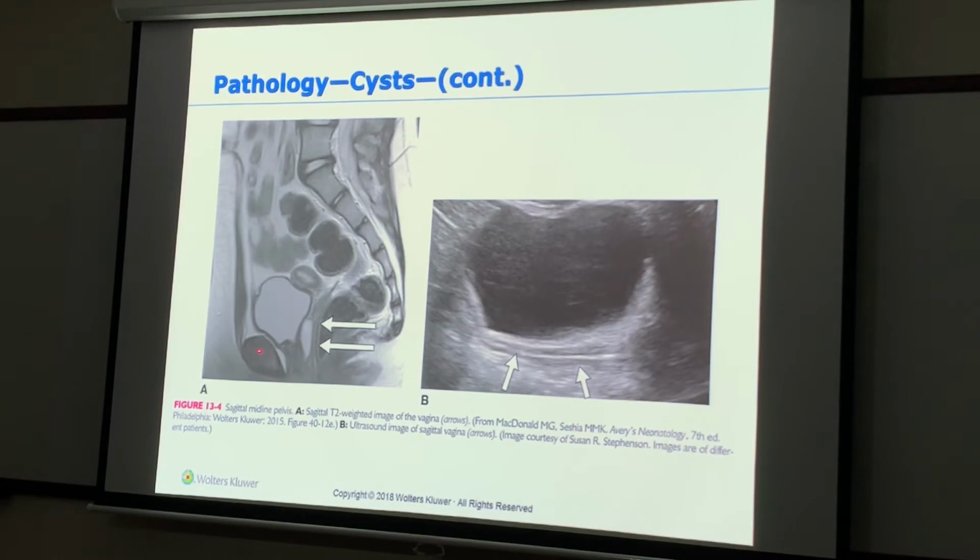Again, what is this? Pubic bone. Retropubic space. Space of Retzius. There's my bladder. This is bladder, anterior. Where's my uterus? The uterus is right above it. Oh, here it is. I see it now. Thank you. Okay, little bitty uterus.